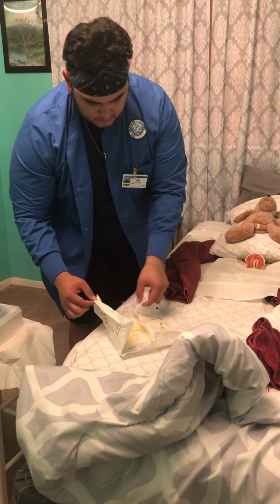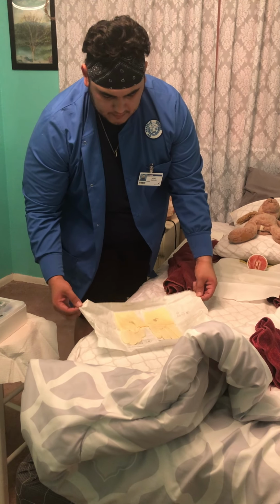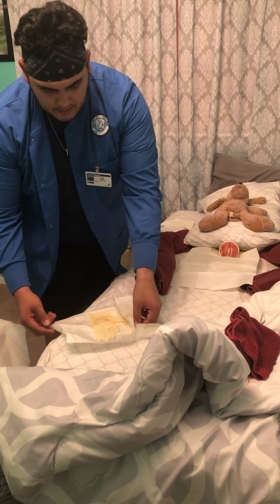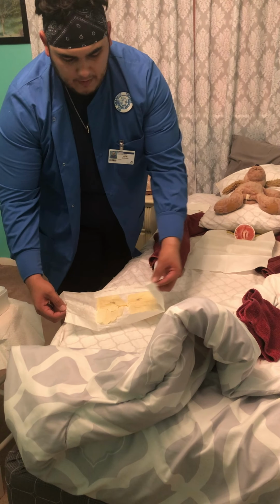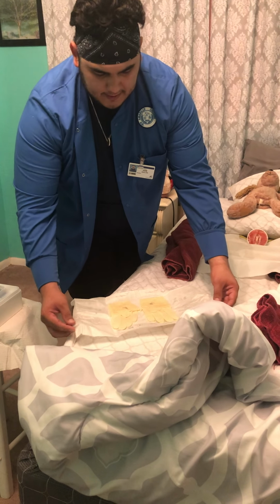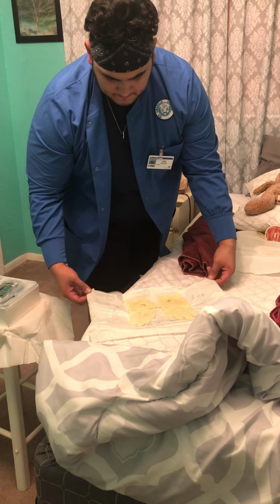And so, when putting on sterile gloves, you always want to make sure, same technique, outer inch only. And you want to try to prevent it from going back inside like it just did. So it's always good to kind of snap right there.